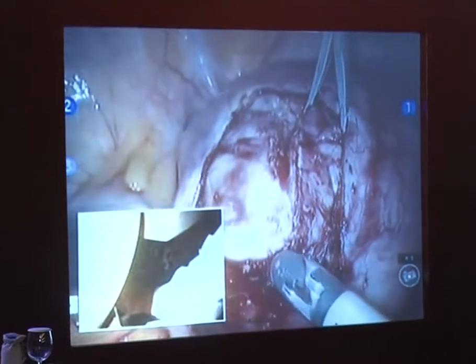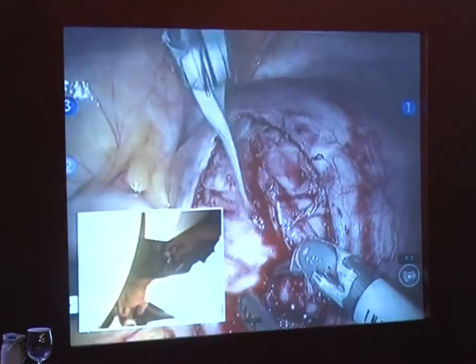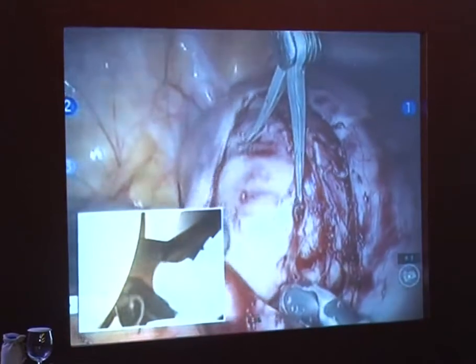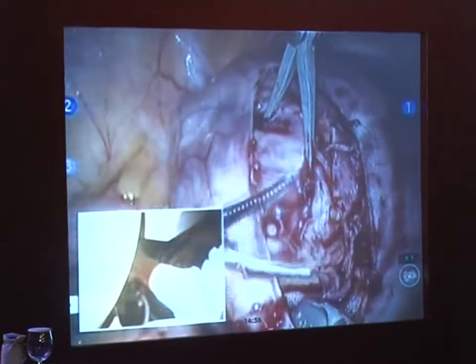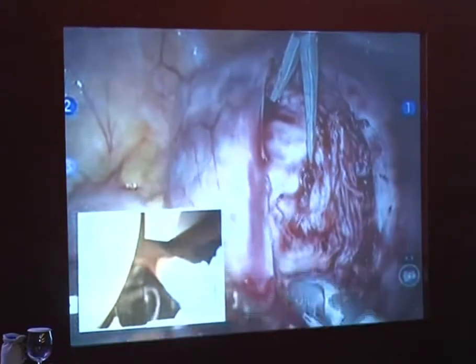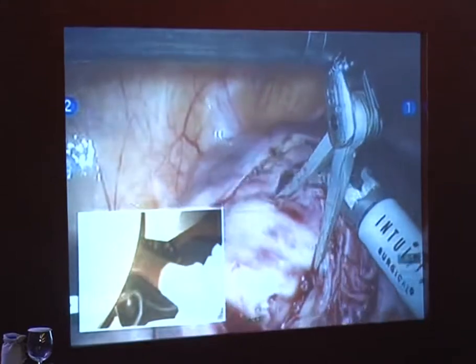Arnie, I just made the observation to the audience how endo-wristed that tenaculum is. You've got it at a 90-degree angle to facilitate your retraction. Right. And the reason I do that, too, is it creates space for me here. If I don't have it wristed like that, then I don't have space to work, because, again, she doesn't have a lot of room. But what I'm going to try to do here is see if I can make this easier on myself. Can you do me a favor and try to pull the uterus into the vagina more, into the pelvis? Like, let it come in as if you're trying to deliver it out. Okay, great. That gives me a little bit more working space here, as you can see when she pulls it downward like that.